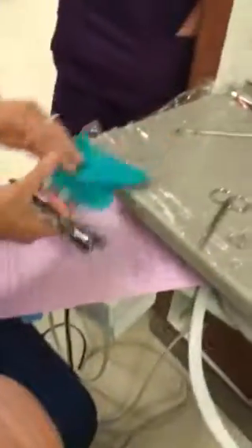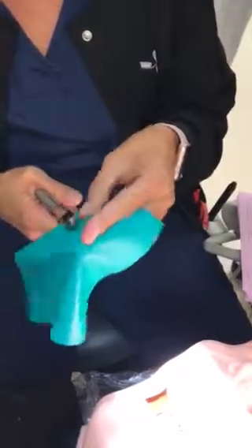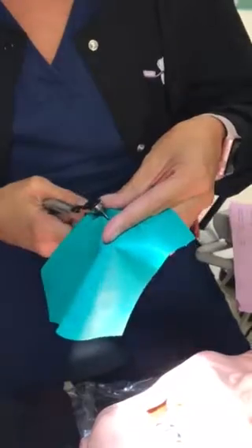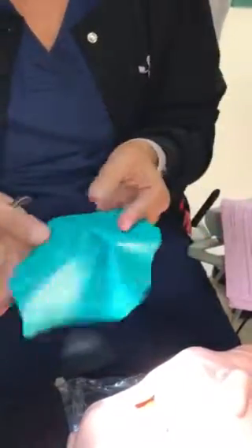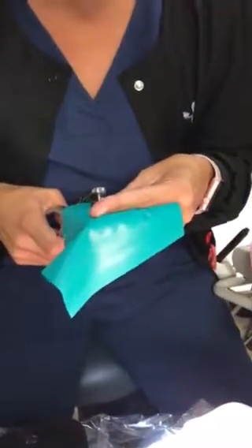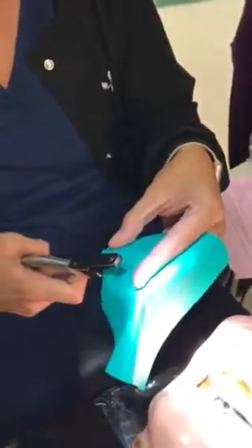So then I'm going to punch my holes. Now for the first premolar and for the canine, I'm going to use a size 3 since they're about the same size. So I'm going to go to my first premolar, punch that hole, remember, pull through the stylus. Then I'm going to go to my canine, punch that hole, pull it through. And to save myself some time, I'm just going to go over to the other side, and I'm going to do my first premolar over here. And I'm going to do my canine.